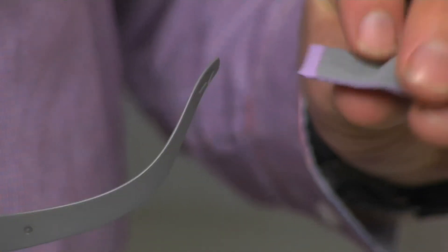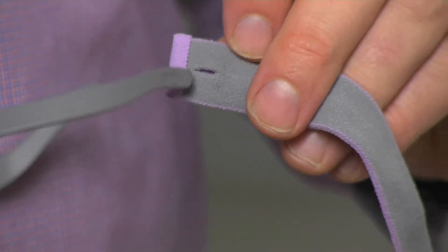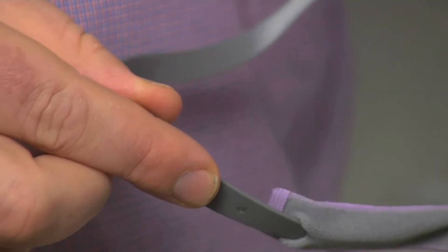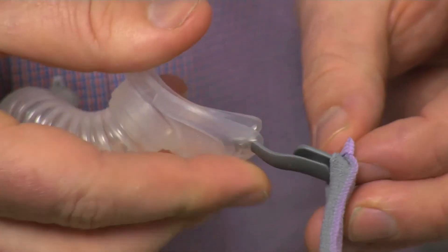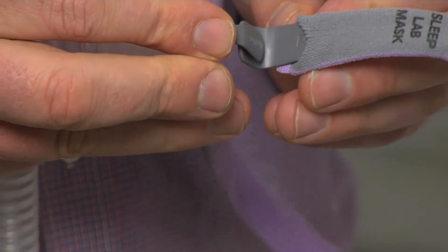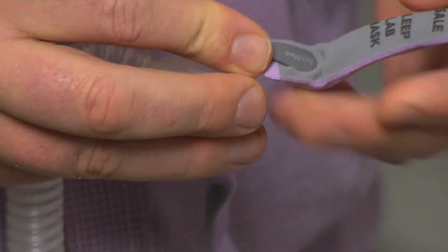So whether you've just finished cleaning your mask accessories or you've just received a new accessory package, the next step is to put the mask back together. The first step is to find the slit in the headgear and then slide the frame into that — it can be a little bit tricky. Slide it in and then slide it over the connection point on the frame, then repeat on the other side of the mask. And there we go, nice and simple.